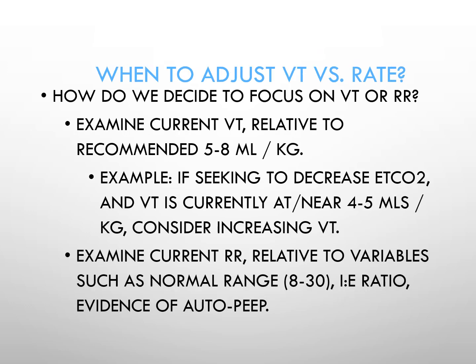So the preceding slide was showing you various conditions, most notably a respiratory acidosis or alkalosis. For a minute here, let's focus on the respiratory acidosis. I'm also an item writer for the National Board for Respiratory Care, so I write a few of the questions that appear on the exams.